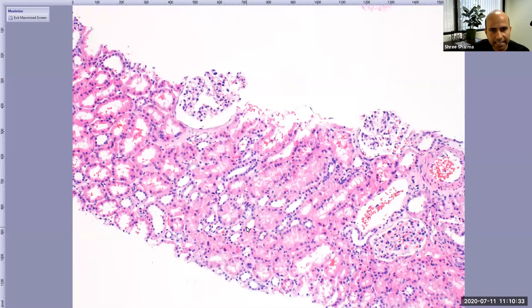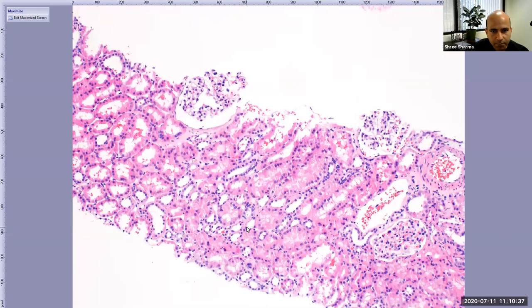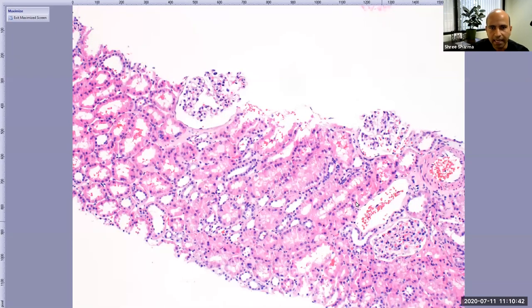In this particular case, this stain is known as hematoxylin and eosin, or H&E stain. This is a basic stain — when I apply this stain, I can appreciate the basic morphology of the kidney. On low power I decided I am in the cortex, looking at the kidney. Moving to higher power, I identified glomeruli and tubules in the background, as well as blood vessels.